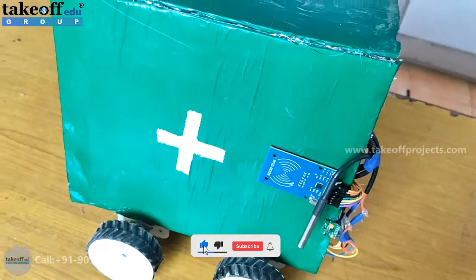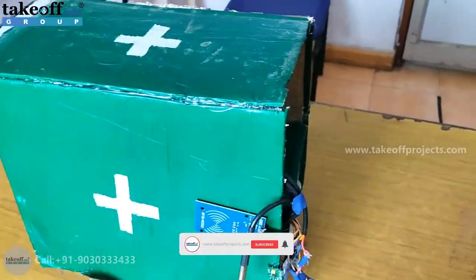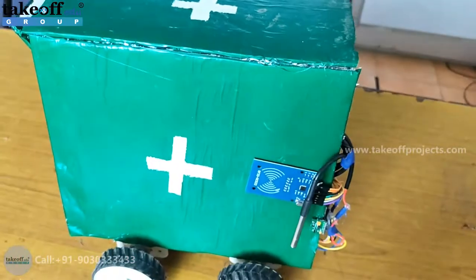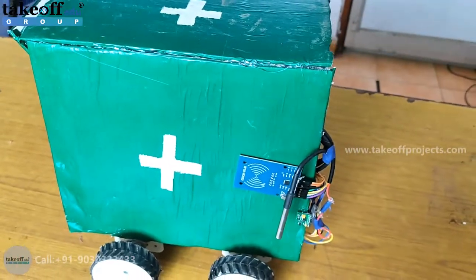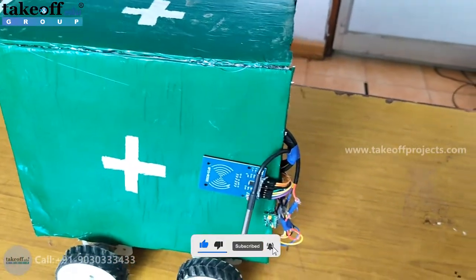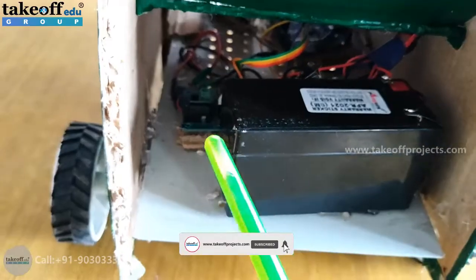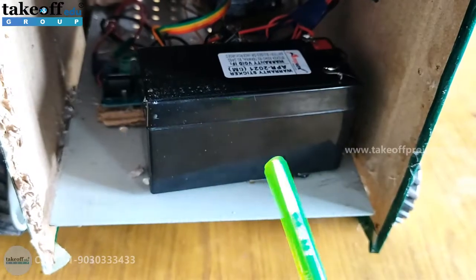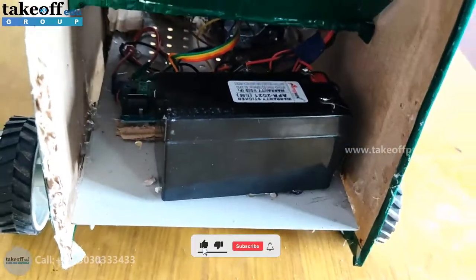There is also one more module inside this robot — the L293D module, which is a motor driver that helps change the direction of the robot. You can see that from here. And this is a 12-volt rechargeable battery.